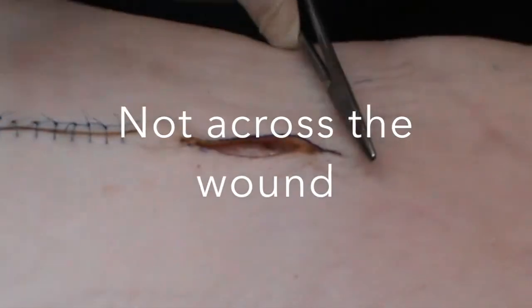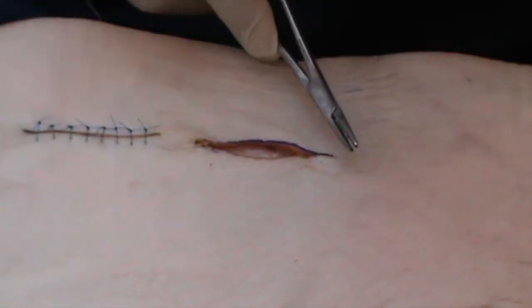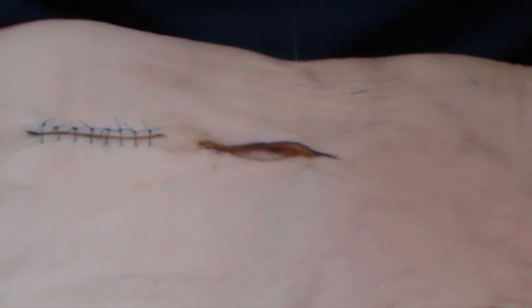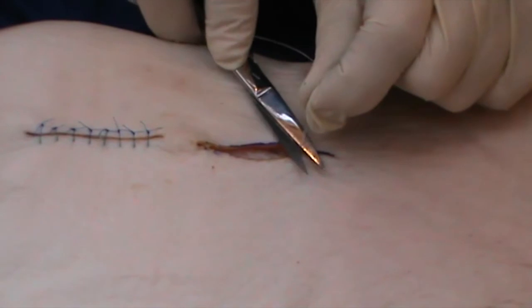Instead of like this, which would merely put tension on the wound, you close it along the length of the wound. One, two, three. So, this is now closed with the knot deep to the skin.